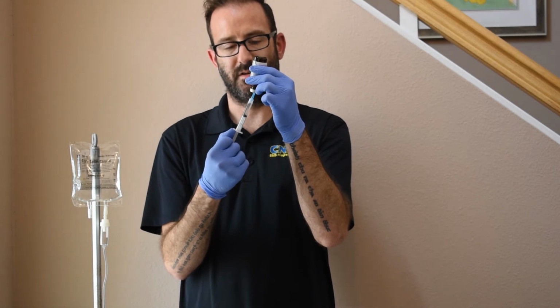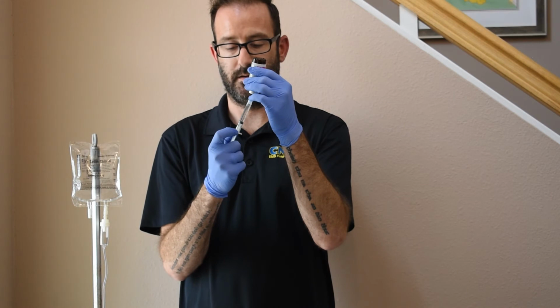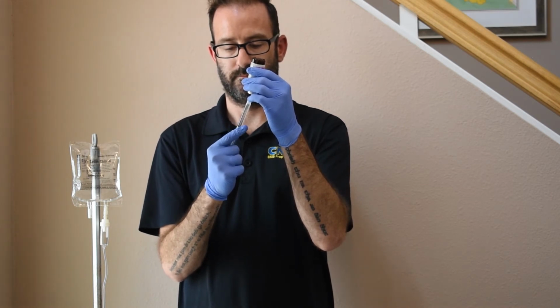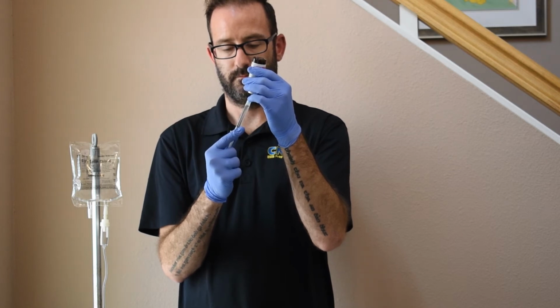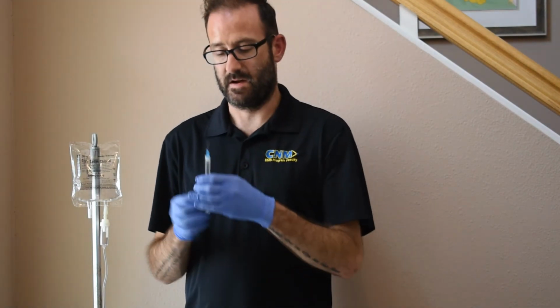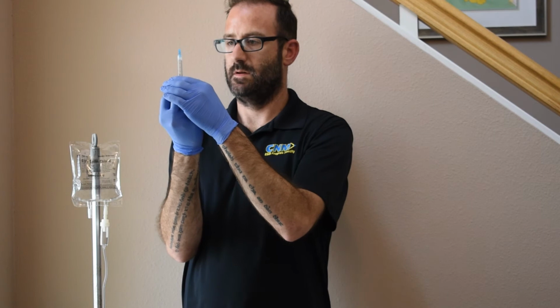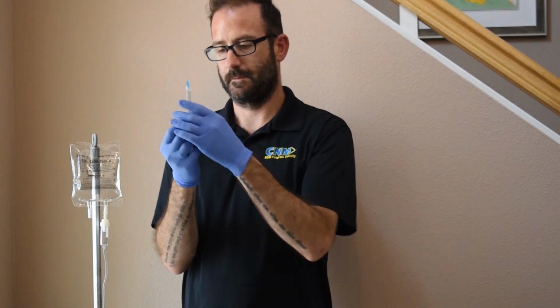If I go too fast, then I'm going to get a lot of air bubbles as I'm pulling the fluid back. Okay. I'll place my vial down. I'm going to get all of my air bubbles to the top. I'm going to dispel any of the air.